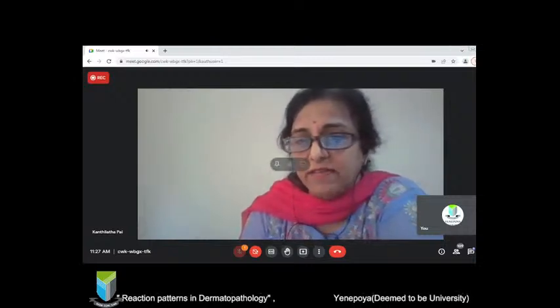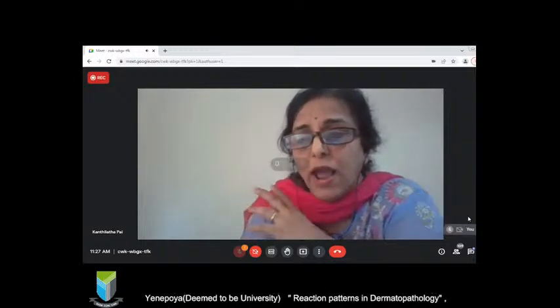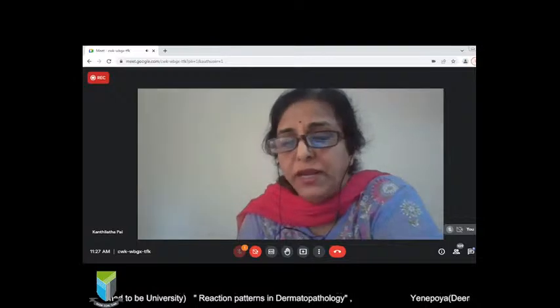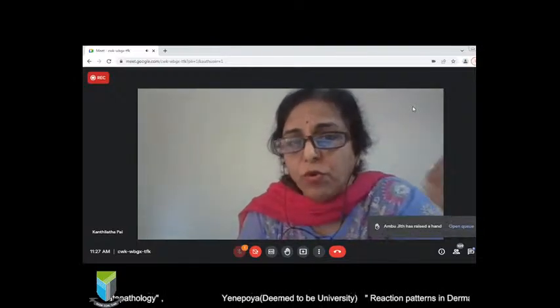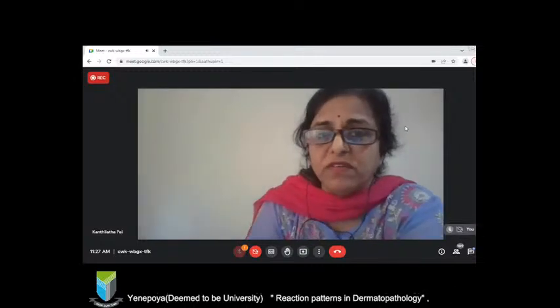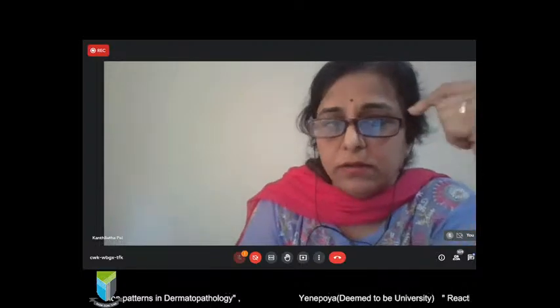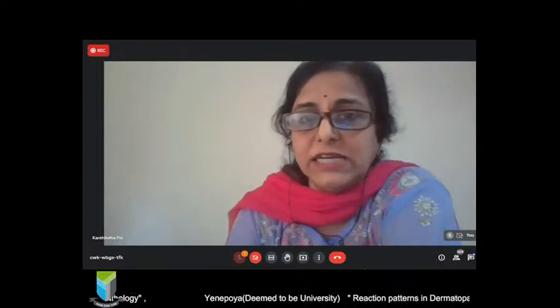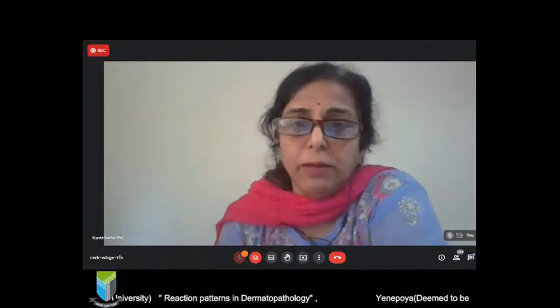Dermal changes, as I said, could be superficial or deep perivascular. Suppose you have only dermal changes predominating, then it is one of these. Today's topic mostly deals with inflammatory dermatoses where the epidermal changes predominate.